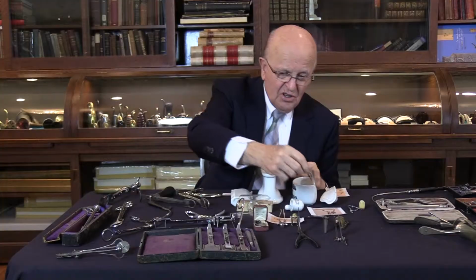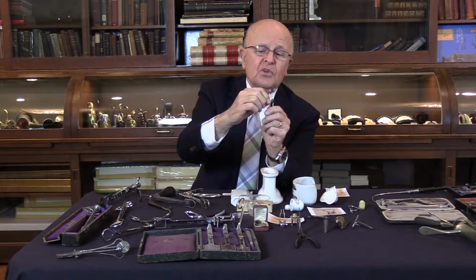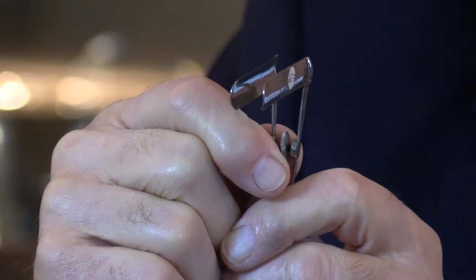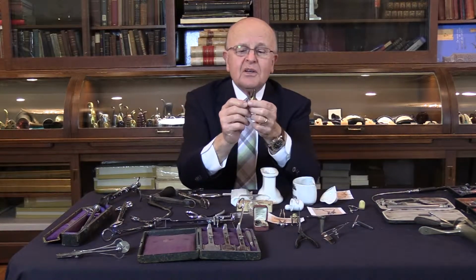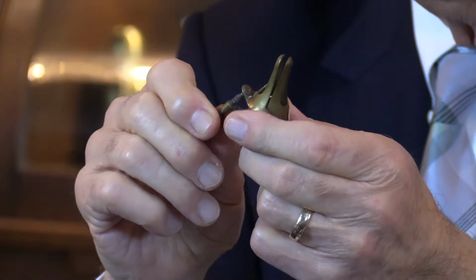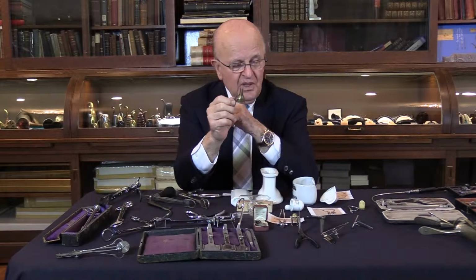So this was later replaced by this kind of nasal speculum. As you can see, you can just move the screw here, and it opens and closes it. This was called the Bower's nasal speculum. Later on, another kind of nasal speculum, where you just move the screw and it opens and closes, is the Duplay, D-U-P-L-A-Y, nasal speculum. It came in silver, in stainless steel or in copper.